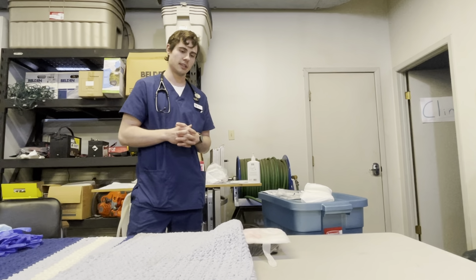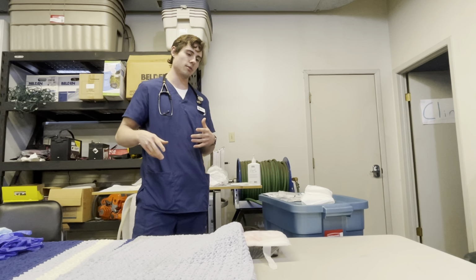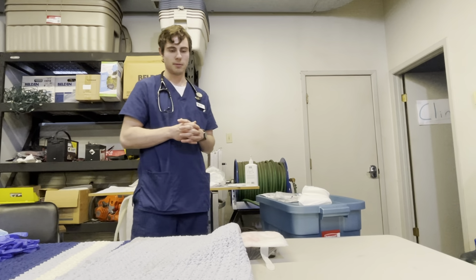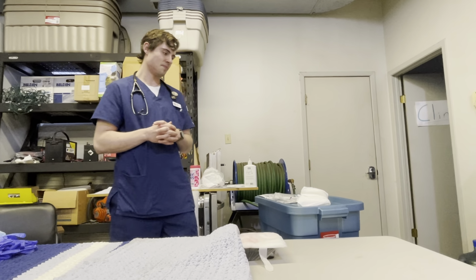So I'm going to explain the procedure. So today we're going to be doing wound care. We're going to be taking off your old dressing, assessing the wound, cleaning it, and putting on a new dressing. They're going to cooperate and are willing, so we can continue.